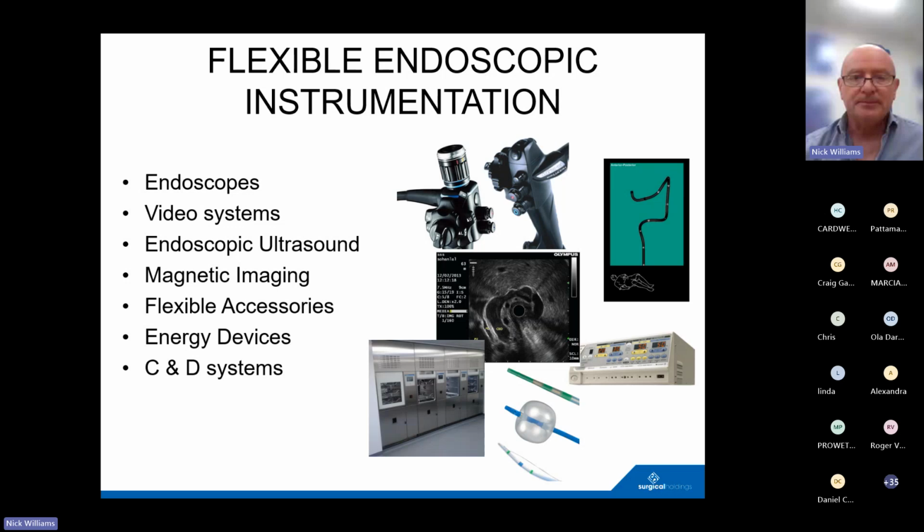So let's look at the scope. Well, first of all, sorry, I should say endoscopic instrumentation. There's lots of other sides to it. I'm going to talk about the instruments in a minute, but there are video systems. This is a good example of, excuse me, that's a fiber optic instrument.